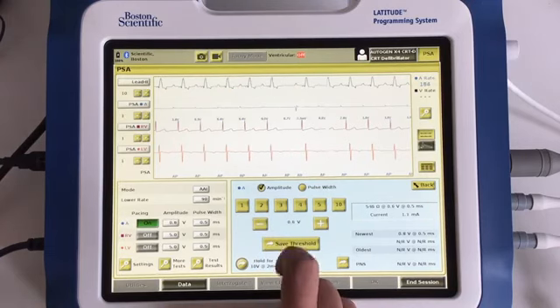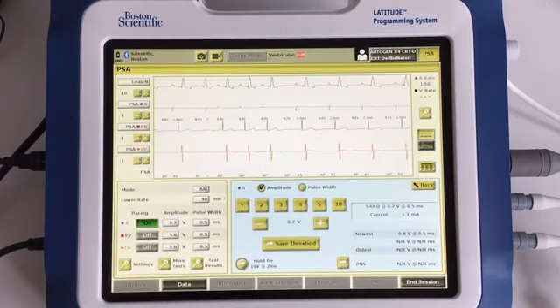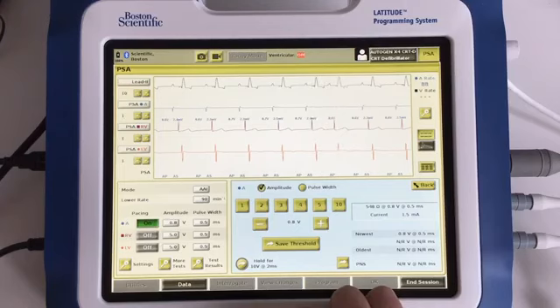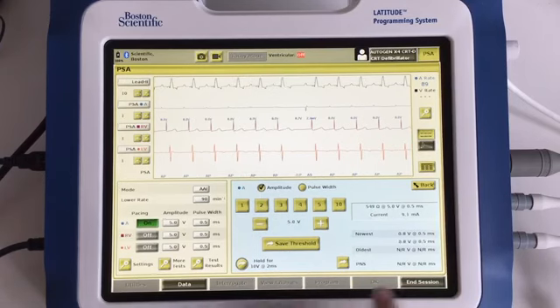You can see that we're now missing and the current voltage is displayed on the screen, so we'll come up, so we've got a stable threshold, in this case 0.8, and then we can save that as our threshold, which you now see over here.